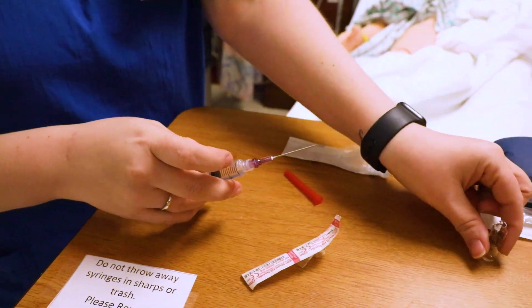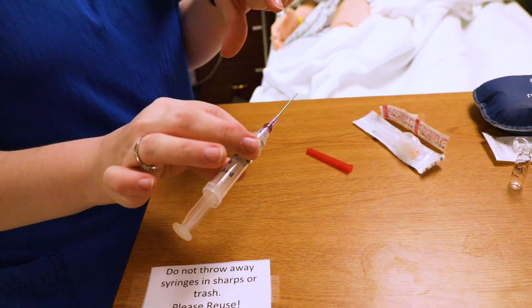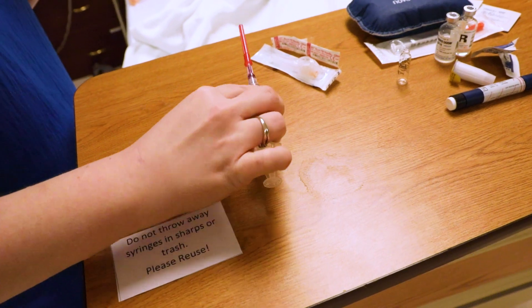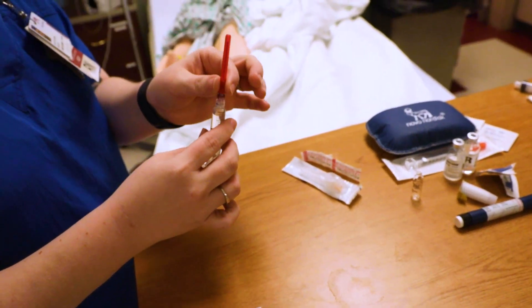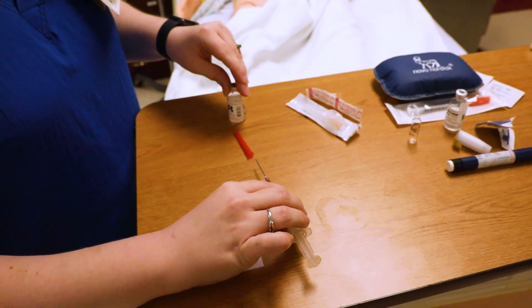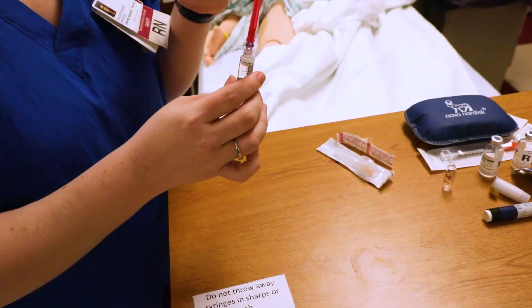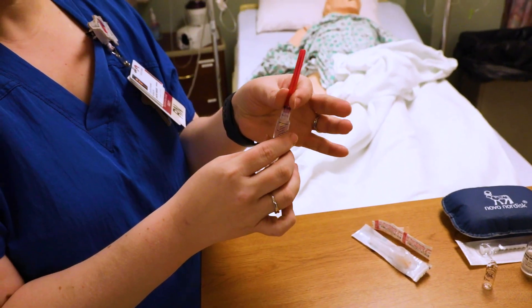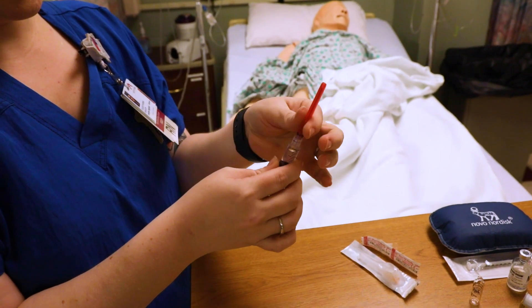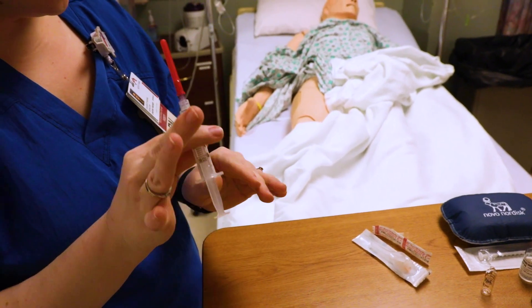Pull the needle straight back out and put it in the sharps. When you go to recap your needle, remember we don't just recap — you always use the scoop method. Put the needle in like this and lift it up. If you have difficulty, put something against it to give you a little leverage. Then to secure the cap, make sure you only grab down here — if you grab up here you risk the needle going out the side.